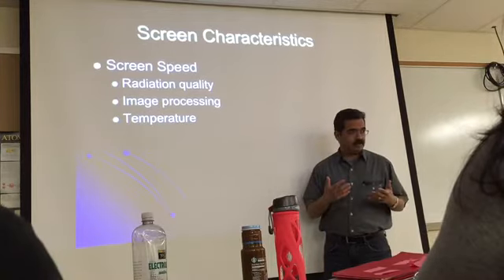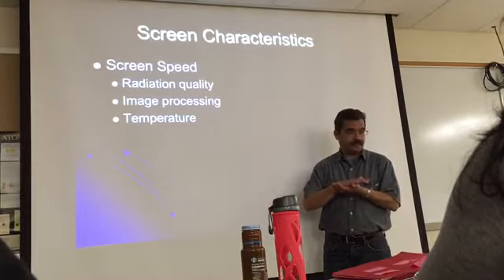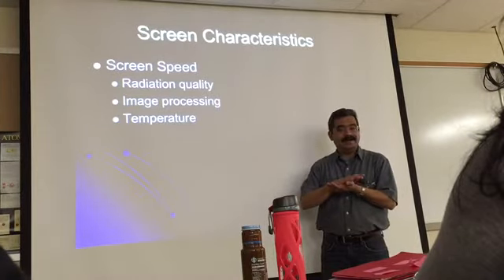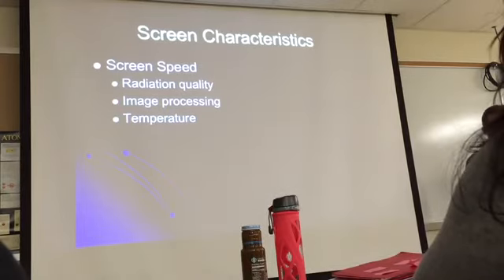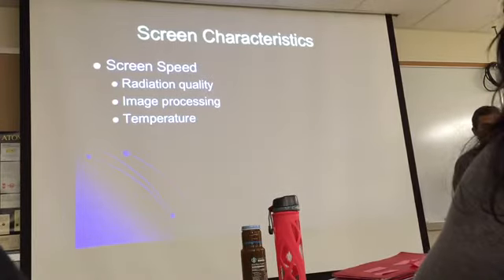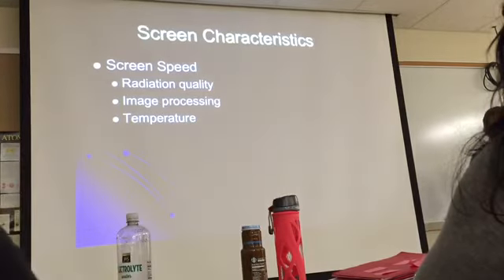There was no change. The change was made with the screen. Following me? Now, you also had another set of film and screen for mammo, and mammo did require a separate processing system. See the difference?